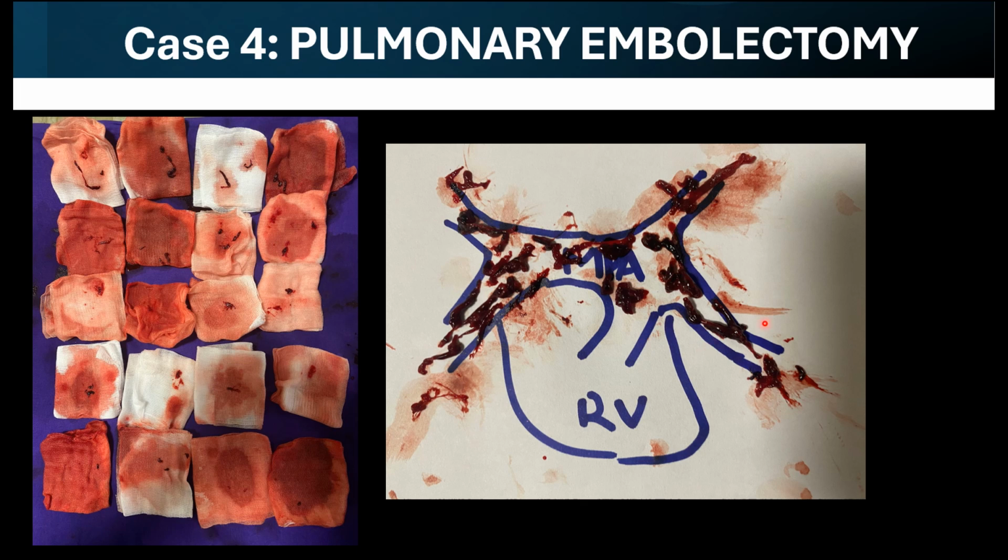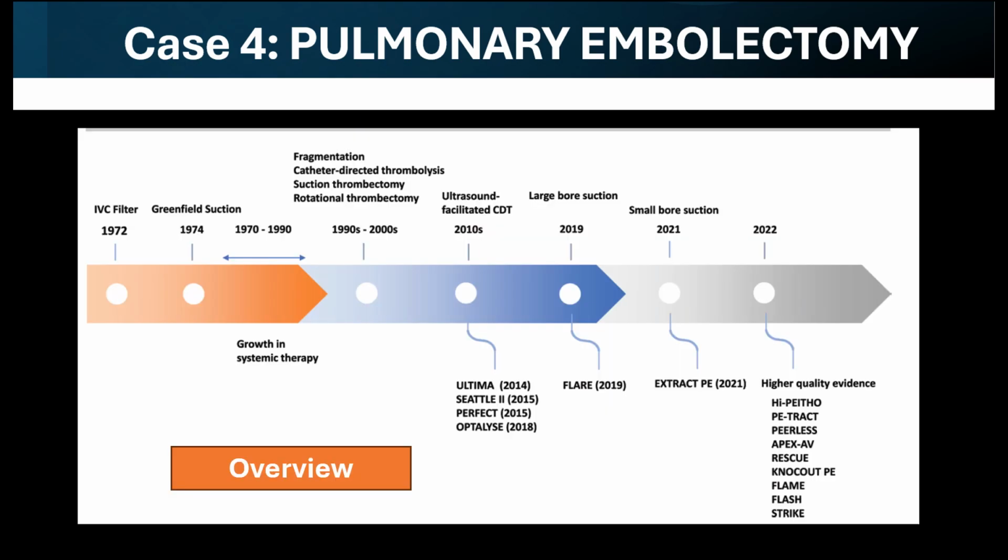So on table, this was a 25-year-old lady with a recent LSCS history. So we couldn't IV thrombolyze her. Patient came with NORAD support of 20. And by the end of the procedure, once I aspirated all this clot, the NORAD requirement came from 20 to 3. That is the beauty of IR actually. The results are seen instantly, and this is even without thrombolysis. We couldn't thrombolyze because there's a history of major surgery.